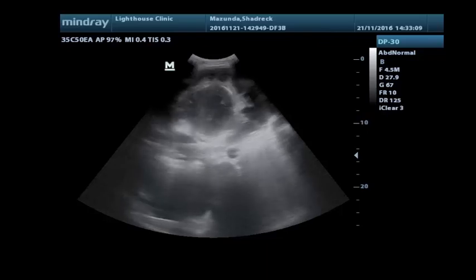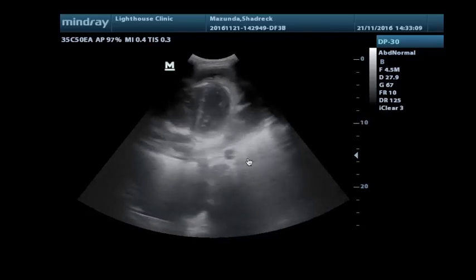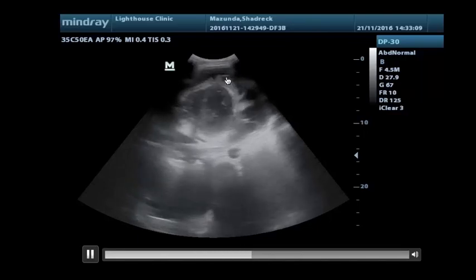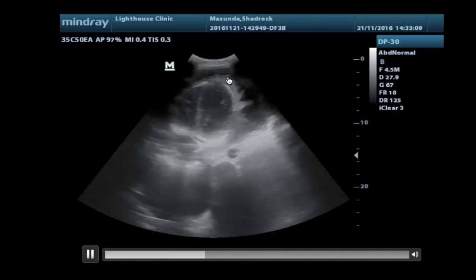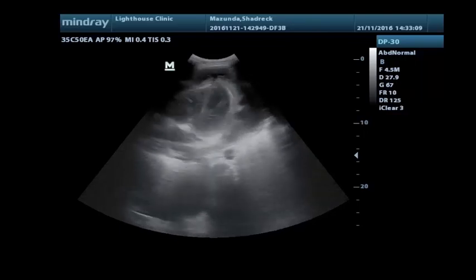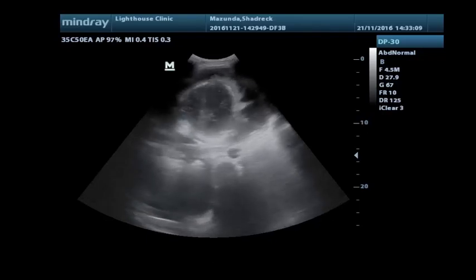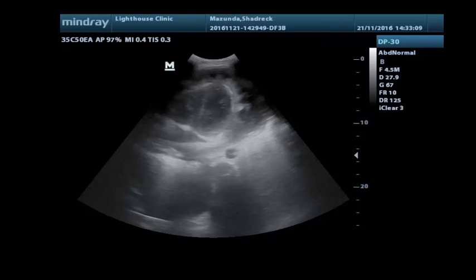And here's another one, larger still, the effusion, because of course here you can see the right ventricle, left ventricle, and on this heart is like a cap. There are these fibrin masses, strands, which float in the fluid as the heart moves during the cardiac cycle. Yes, so this again is a very typical fibrinous exudative TB pericarditis.